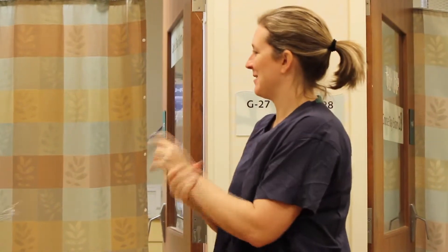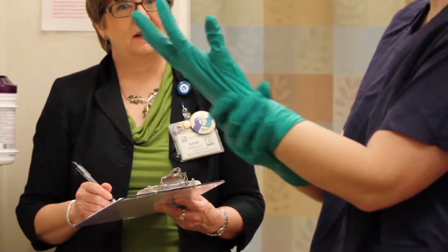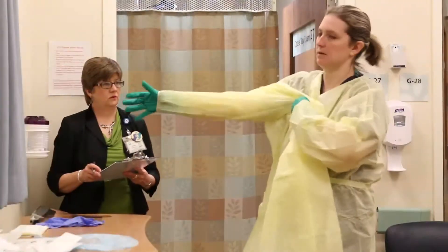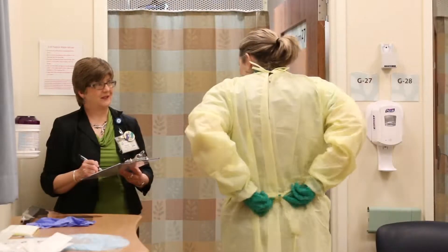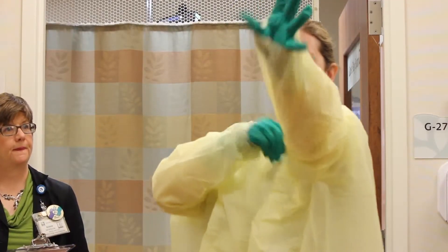Sanitize your hands again with Purell and don your first pair of surgical gloves — these should be tight-fitting. Put on the first impervious isolation gown to cover the back of your body and tie it in the front. Then, put on the second gown to cover the front of your body and tie it in the back. Your donning buddy can help with this step. Place the wrist cuff over your gloves.